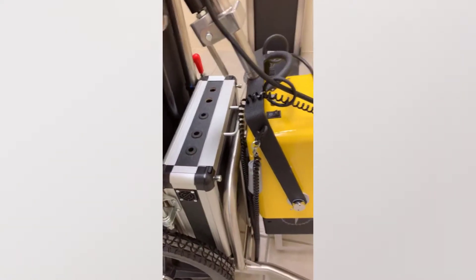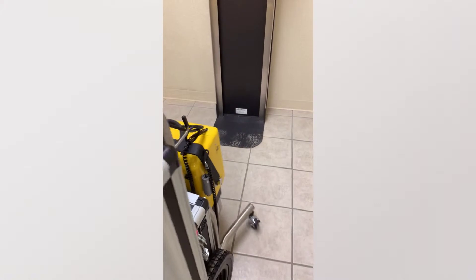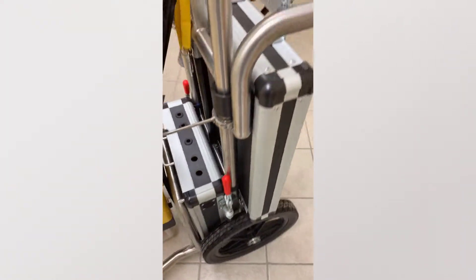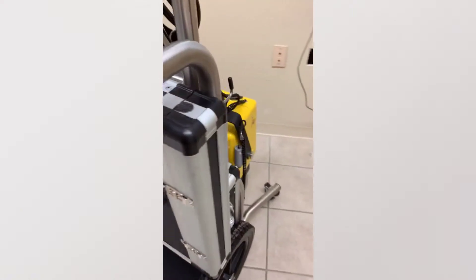The nice part about this particular system is the way that it moves. As you can see, you can roll this around and position this. It's easy to roll and position.